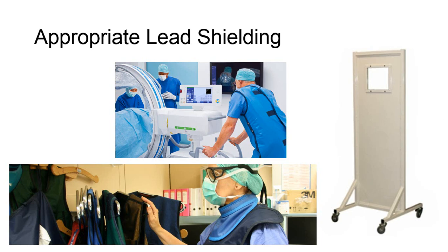don't make any assumptions. Just as you are responsible for putting a 6-foot distance between the primary beam and anyone else during routine portable X-rays, this is also your responsibility. If no lead aprons are available, you may have to wait for them to exit the room, or sometimes they'll have rolling transparent lead equivalent shielding within the OR suite that they can get behind. Just be prepared to find extra aprons for staff and be willing to help them fasten up their surgical gowns over aprons if you're in the room prior to opening.